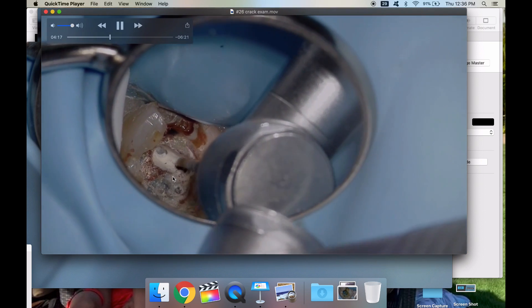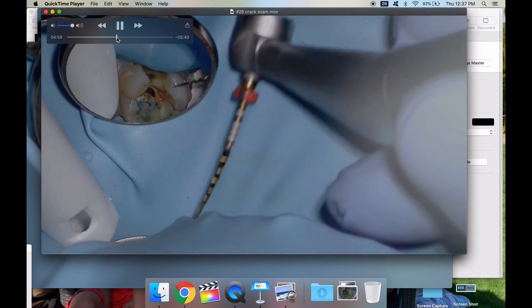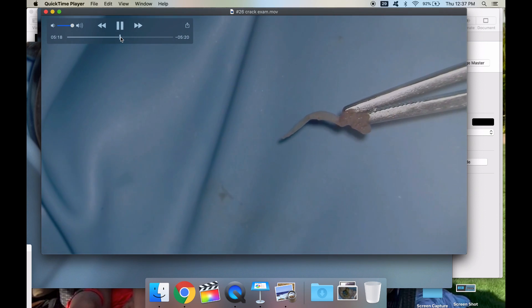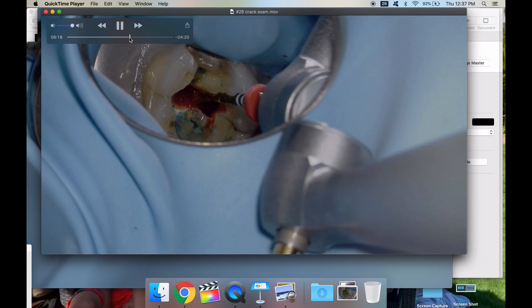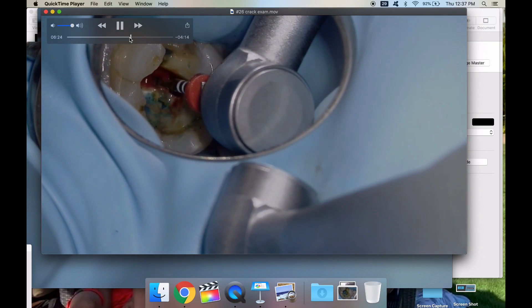We're going to do a big rinse. We're into most of the pulp chamber now. I'm going to take my Wave One Gold and orifice open — and just for fun, I got the palatal nerve out so let's look at that under high power. I take the Wave One Gold to 16 millimeters, which is the cutting flutes, take that to a reference point, and that opens up the coronal two-thirds. It's such a fast way of cleaning and shaping.